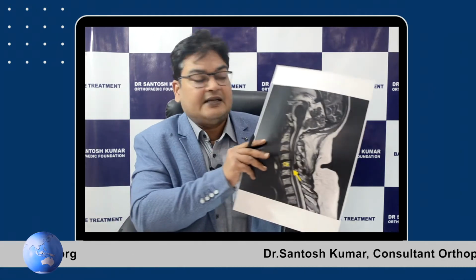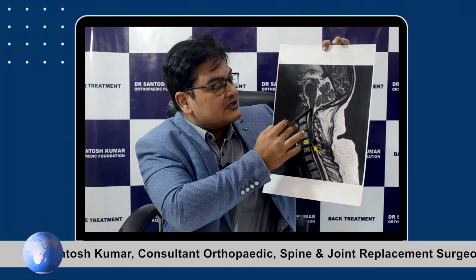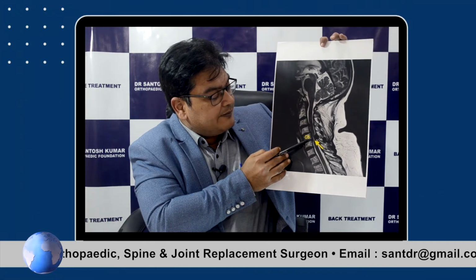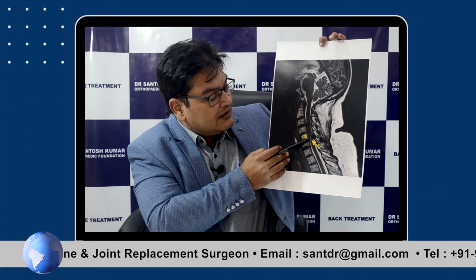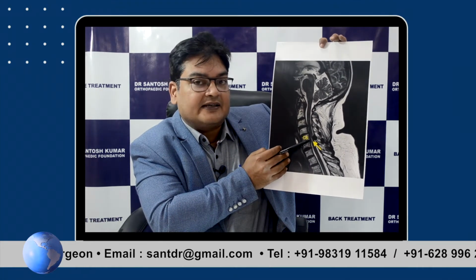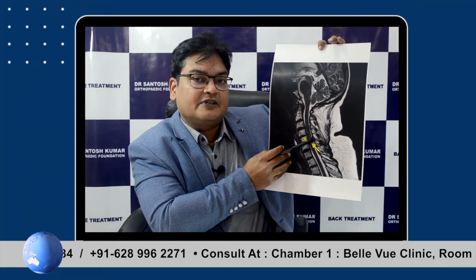This is an MRI, a cervical spine neck MRI. This is the upper brain. The one which is above the spine is the brain, and this is the cervical spine MRI. It has got a big disc prolapse at C5 level. Now this part is the spinal cord, the spinal canal, and this can get encroached or compressed from both sides, from front as well as behind. From front the disc compresses it, and from behind it is a ligamentum flavum which gets hypertrophied, which gets thickened, and then it compresses the spinal canal.